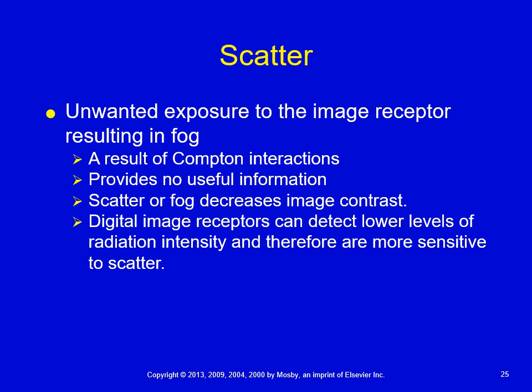So the reason why it's important for you as a technologist to control fog is for this. Not fog, control scatter, is for this very reason. If that scatter radiation, especially if it's in excess, reaches your image receptor, it can decrease that image contrast, make the image worse, and sometimes it can affect whether or not the radiologist is going to be able to read that image clearly. Now, how do you control fog?